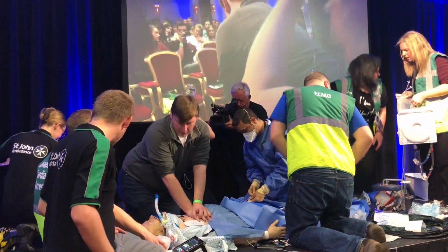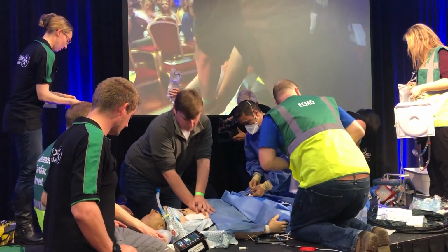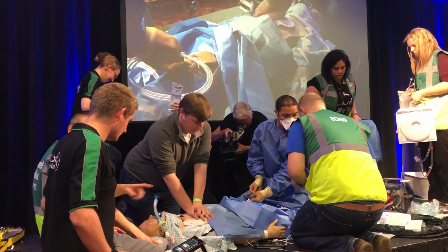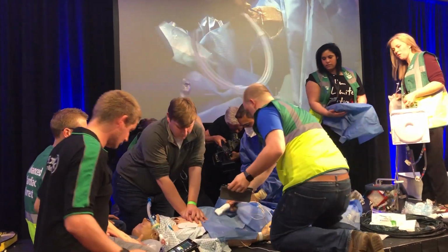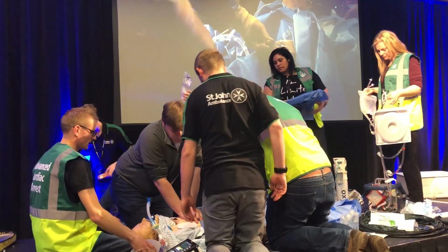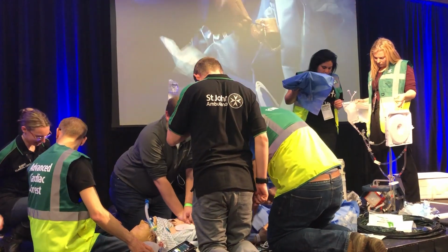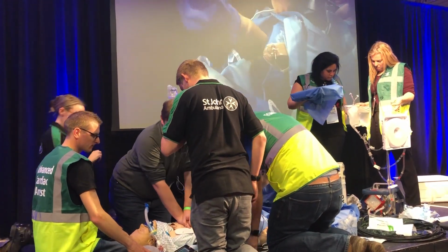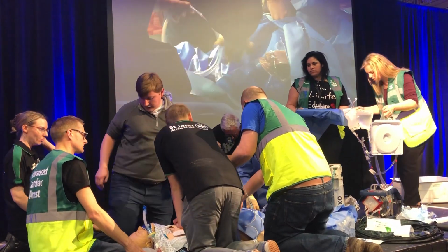It's very hard with ultrasound to see the aortic wire. So for the vein, they'll put the wire in, and then Rob will hold the ultrasound and show the wire coming up the IVC. You see the inferior vena cava up to the right atrium, and we'll know, therefore, it is in the femoral vein. Then when we put the wire in the femoral artery, we'll have the same view, but we won't see the wire. And if it feeds nicely and we don't see the wire in the vein, we will assume that it's in the artery.